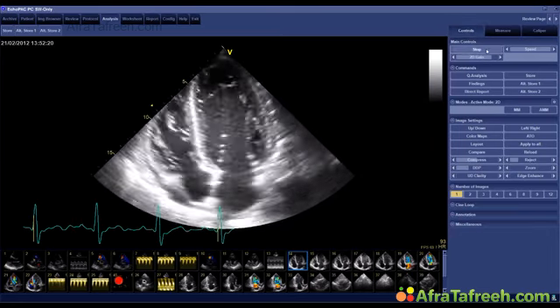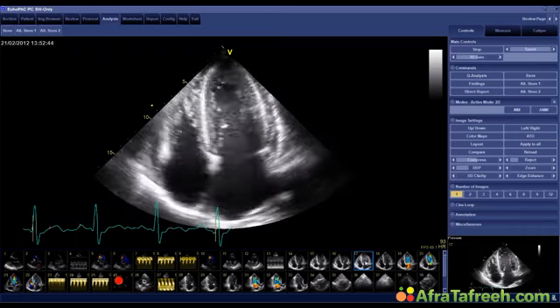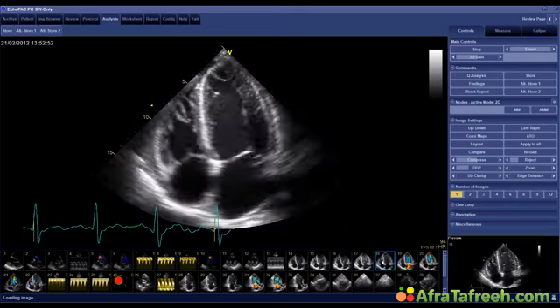Let's take a look at the thickness of the septum, just to give us a brief estimate. 15, which is not surprising. The patient has left ventricular hypertrophy simply because he also has hypertension. Okay? Hypertension caused by his renal problem. Now, anything else you see?